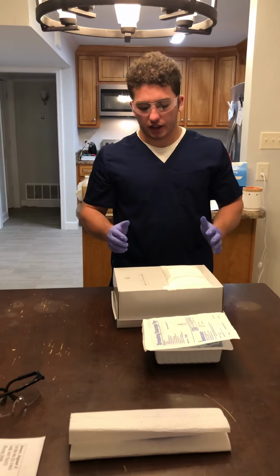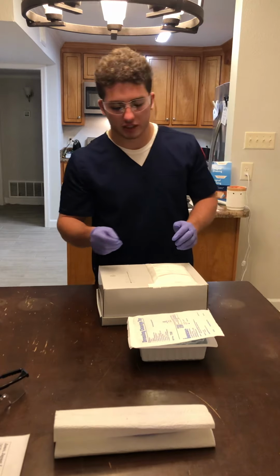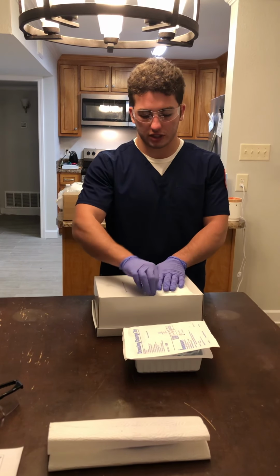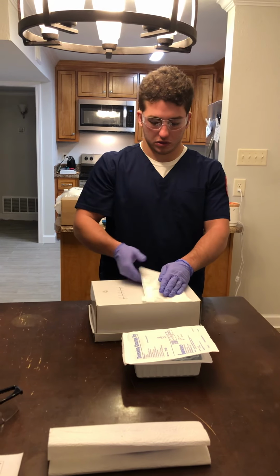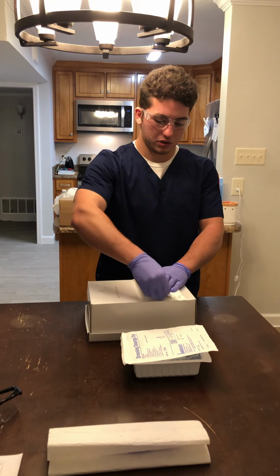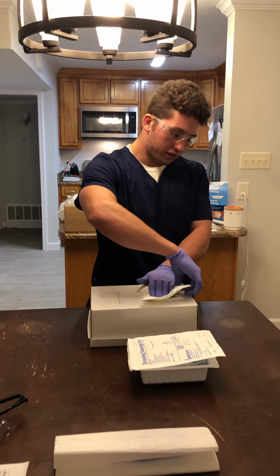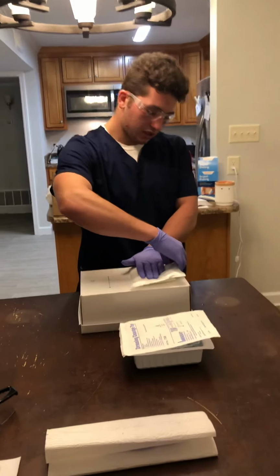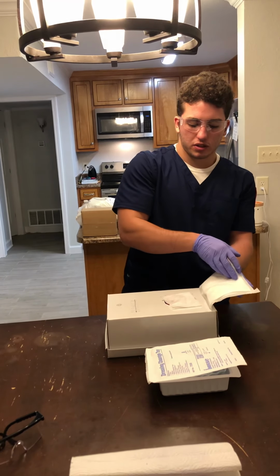Okay, now that I have everything exposed, I'm going to remove this abdominal dressing by pulling the tape towards the wound on all sides. Once I have all of the tape removed from the skin, I'm going to open the wound away from the patient.